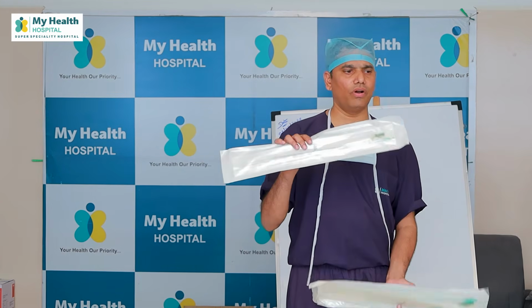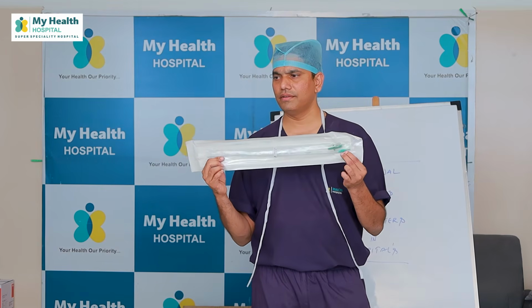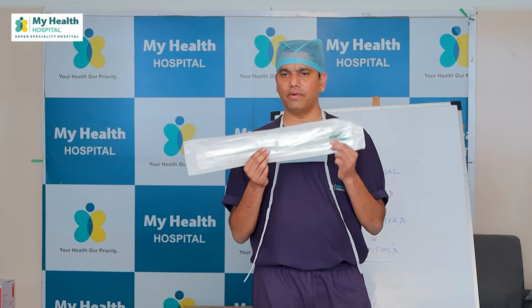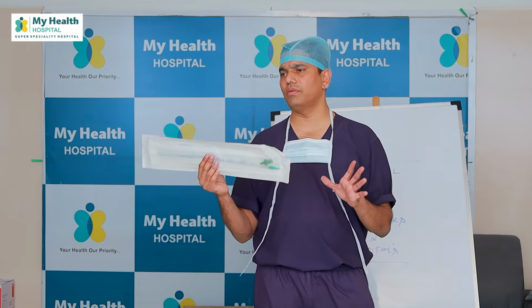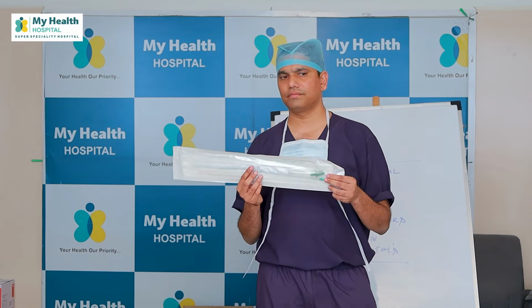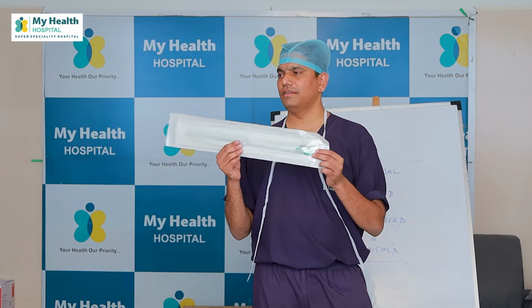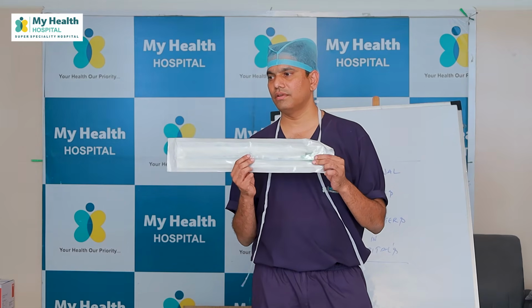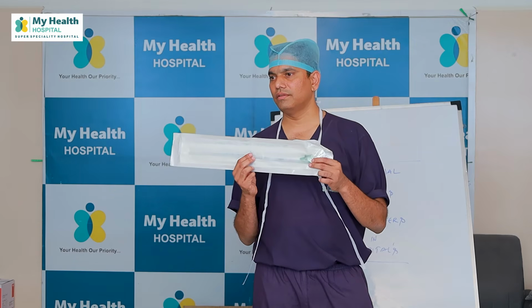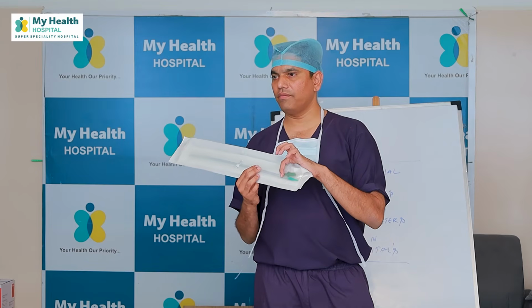It has a tail. Okay. Abdominal drain. Arun, how do you identify abdominal drains? The most confusing part between a chest drain and abdominal drain is both of them look similar except for one point. Is there a trocar in this?